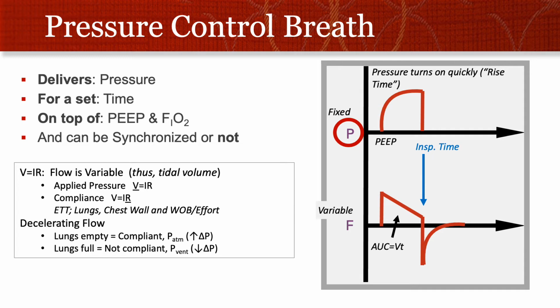Now, like I had you take in deep breaths and pay attention to the airflow over your nose, do that again, and you notice that there is a lot of flow and cold air going over your nose at the start of a breath. And as your lungs fill up with air, there's less and less airflow through your nose. That is shown here on the slide with this decelerating pattern of airflow. And you can feel it going over your nose. And that happens because of two main things.